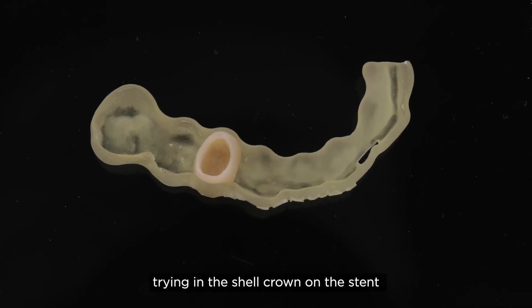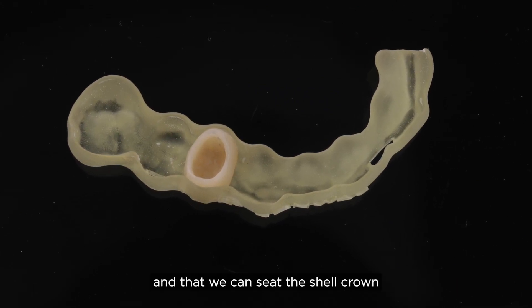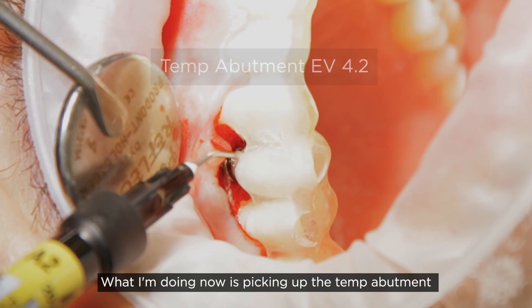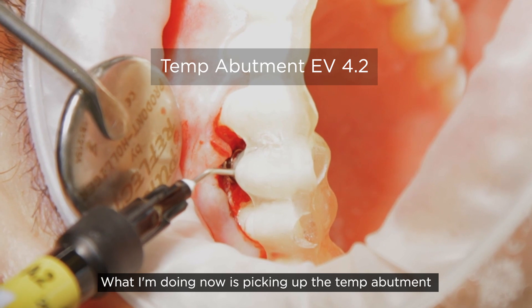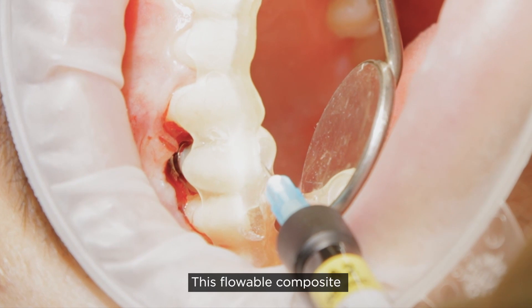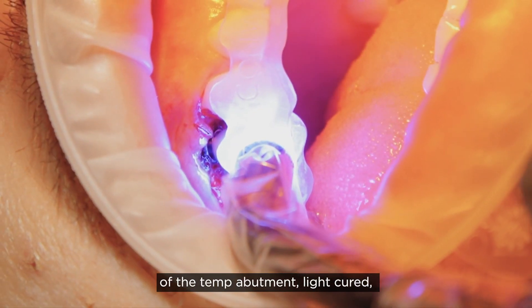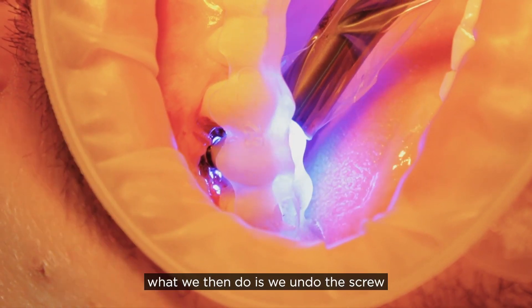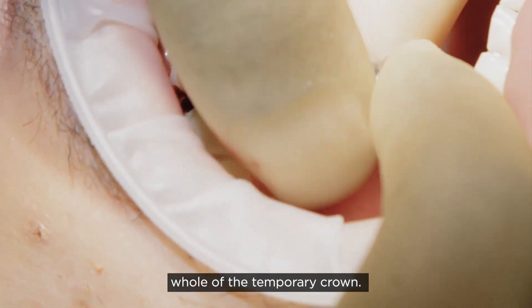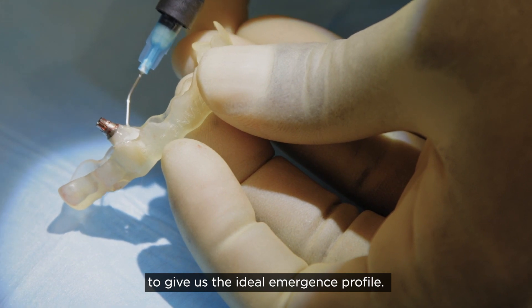We're trying in the shell crown and the stent to ensure that the contacts are adequate and that we can seat the shell crown as well as the holder. I'm picking up the temp abutment and the shell using some flowable composite, which is run in and around the outside of the temp abutment and light cured. Once light cured, we undo the screw and pick up the whole temporary crown, then customize this extra-orally to give us the ideal emergence profile.